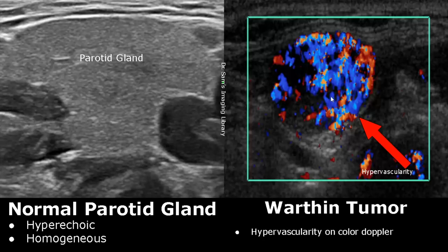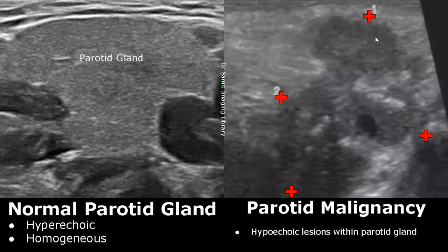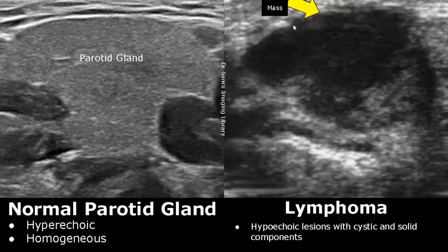Malignancy in the parotid gland has various appearances, but it usually contains hypoechoic lesions which are somewhat irregular in shape. Here is a case of lymphoma which has affected the parotid gland — we see a hypoechoic mass with mixed cystic and solid components.